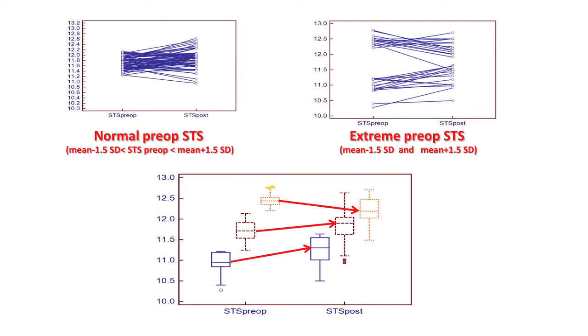Well, this relationship, the measurement pre-op to the measurement post-op, I split it, separating the normal central eyes and the extreme eyes. And this is quite interesting because you can see that the small sulcus to sulcus became bigger. The normal, the central sulcus to sulcus remained central, and the bigger sulcus to sulcus went down a little bit.